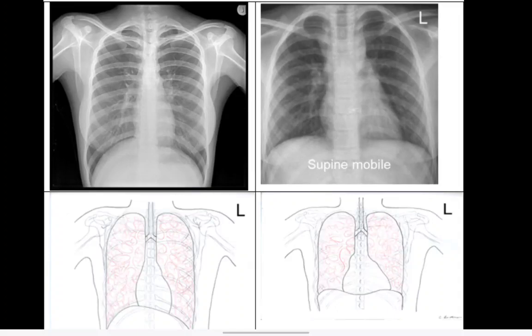Time's up. Now to the answers. Here we have the cardiac configuration smaller than this one. Another thing that they wrote down, supine mobile radiograph, which is done for a patient in, for example, the ICU who can't move to the X-ray room. Then we can do him a supine mobile chest X-ray.